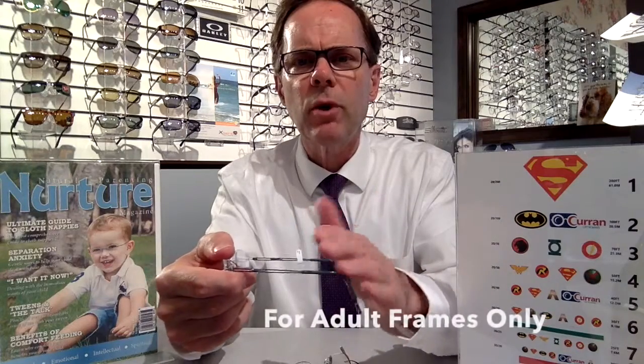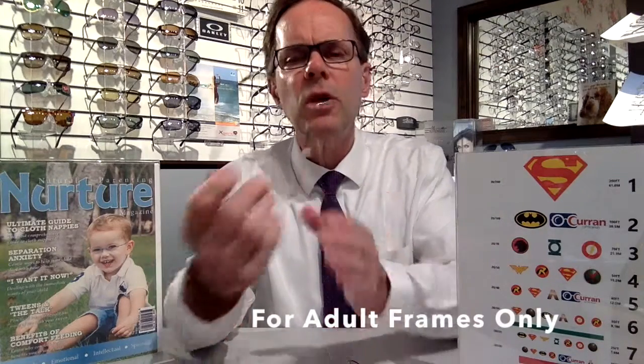Now generally on an adult frame, the bend for the temple tip is pretty much at a 45-degree angle — that's strictly for adults. With children it's a little bit different. We like to have the temple tip bend almost completely around the back of the ear, which just makes for a more secure fit for the child.